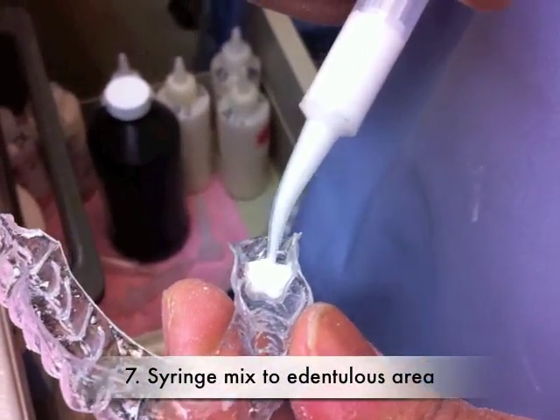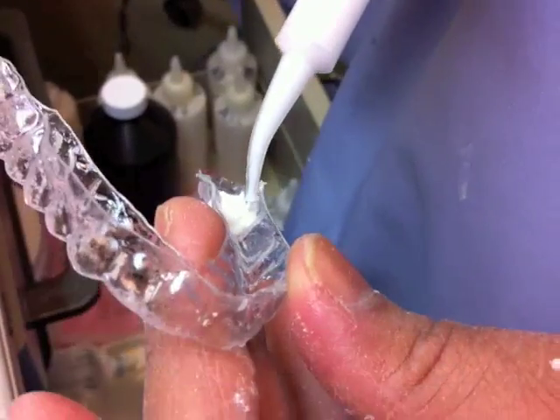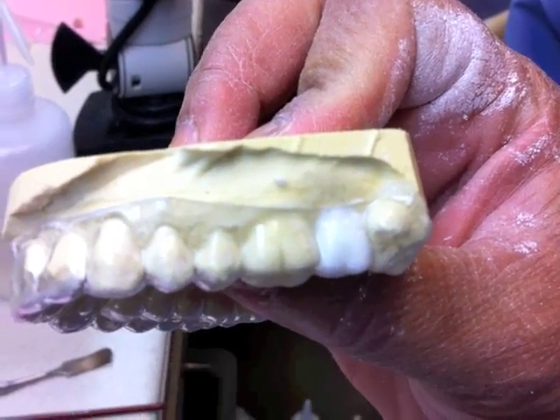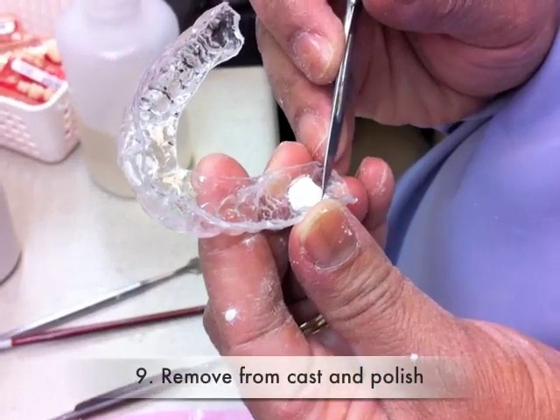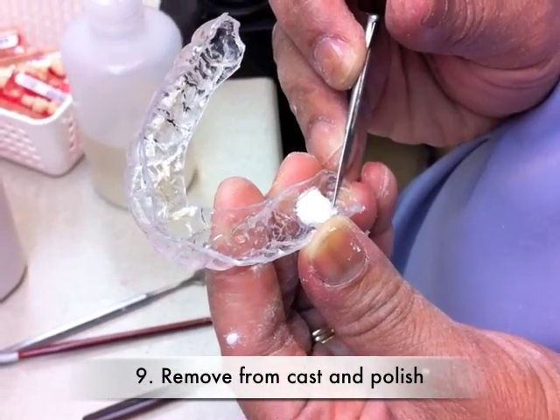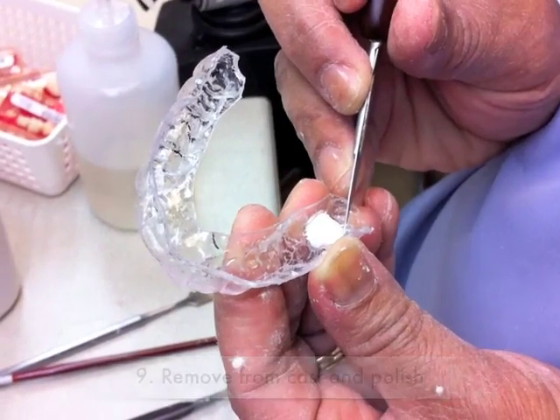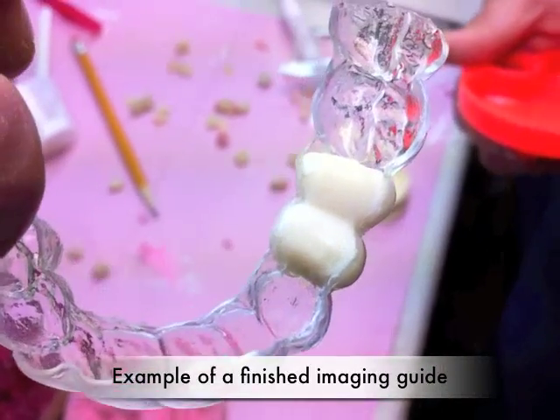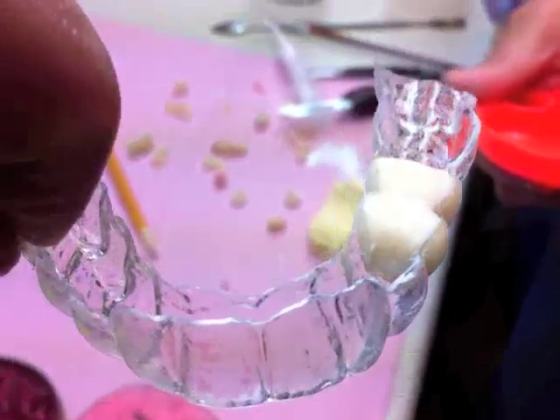You can then use a syringe to flow it into the edentulous side. Then immediately put the tray back on the model and let it set for about 2 hours. Finally, you can take out the guide and trim and polish it as necessary. The patient can take this guide to the appointment with the surgeon, who will then insert it and take the image.